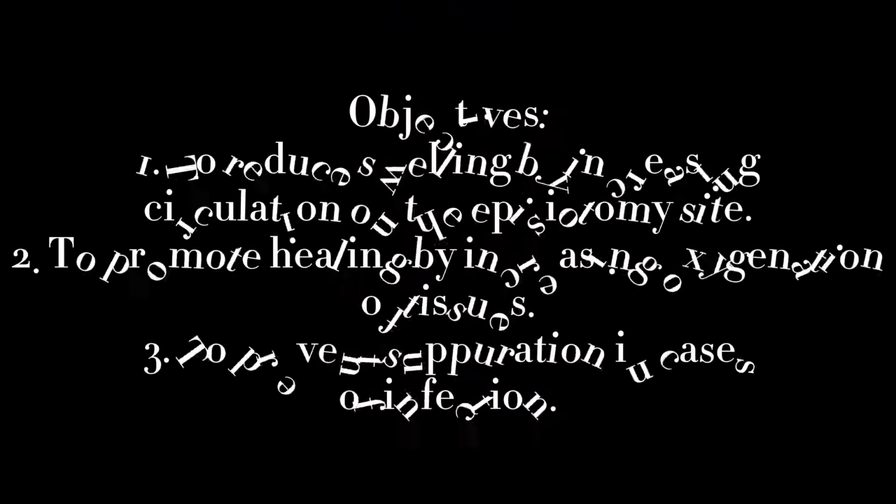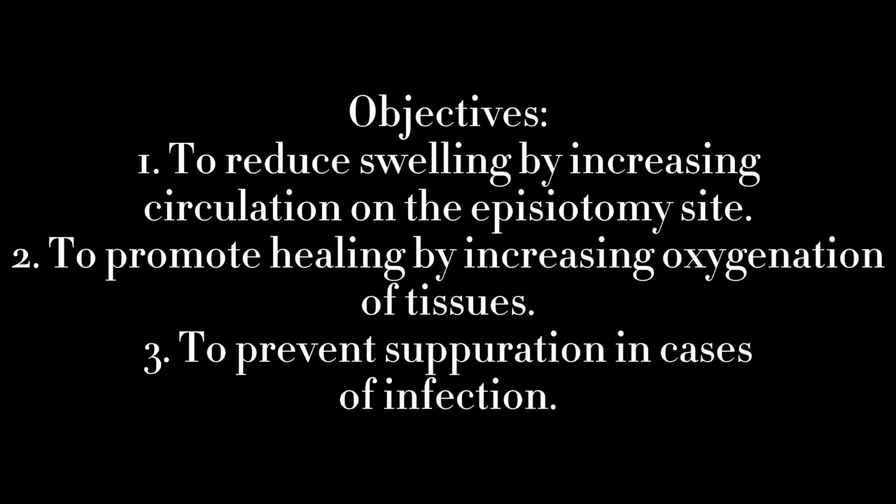Hey everyone, so today we will be doing the application of Perilight procedure. So what are the objectives for this? First, to reduce swelling by increasing circulation on the episiotomy site. Second, to promote healing by increasing oxygenation of tissues. And lastly, to prevent suppuration in cases of infection.